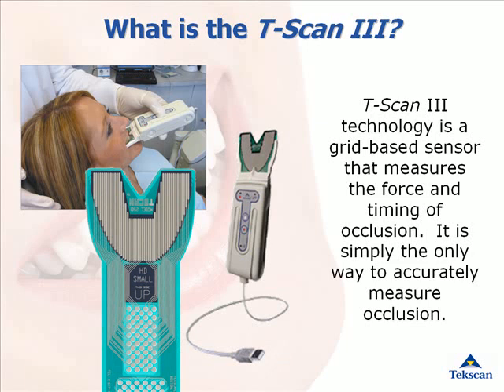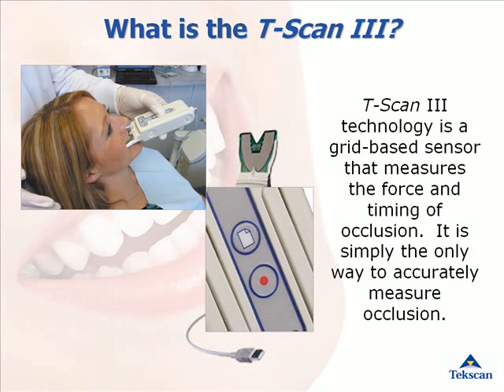The T-Scan handle has two buttons that function on the panel. The first button brings up a new recording window. The second, red dot button, will start and stop the recording mode. You can record a patient going into maximum intercuspation, being manipulated into centric relation, or performing excursive and protrusive movements.